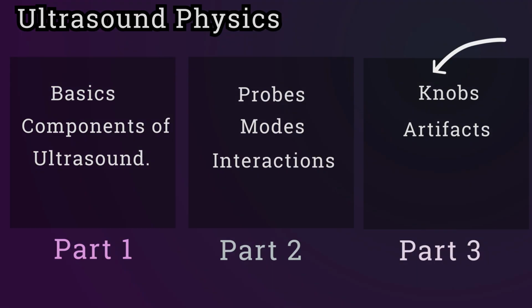The basics of ultrasound, modes, probe types, and interactions with tissue are part 1 and 2 of this lecture series. The full lecture is also available if you would like to watch this 1-hour lecture in one go.